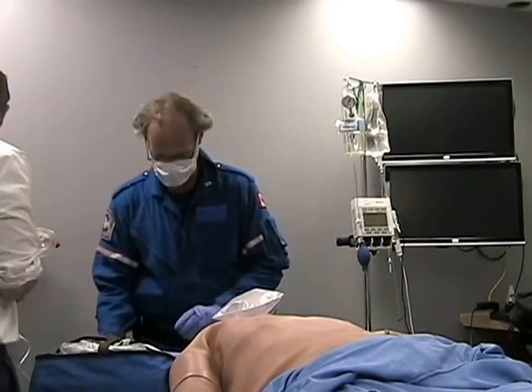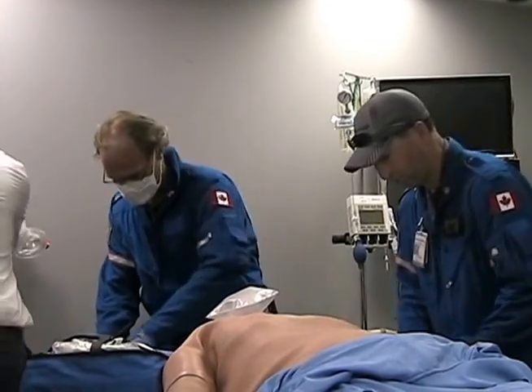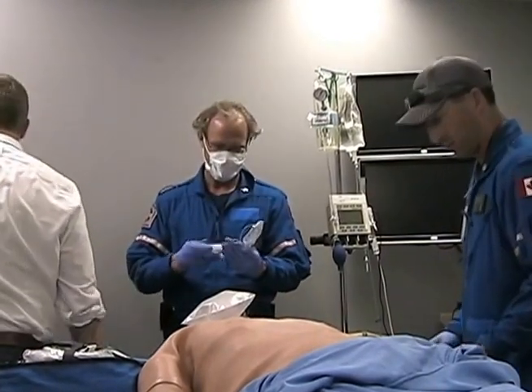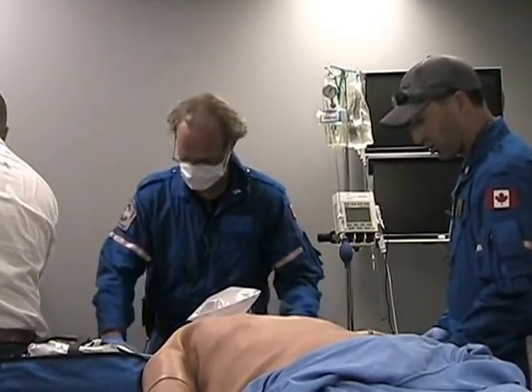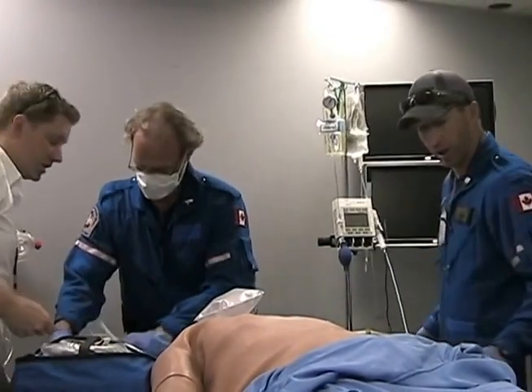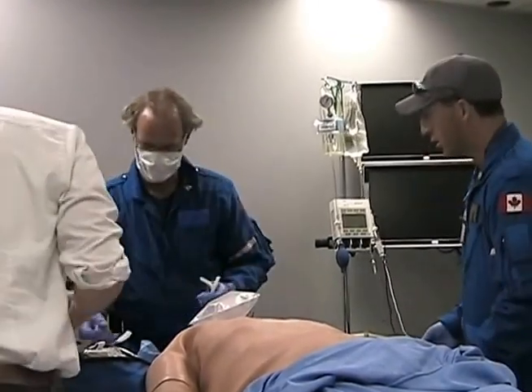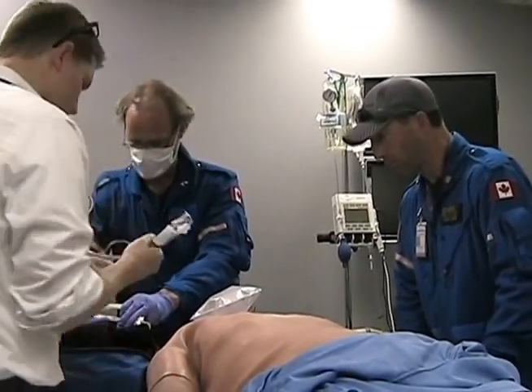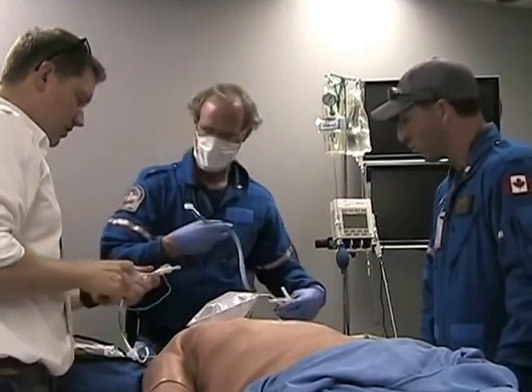Awesome, I appreciate that. Okay, can you test that suction there for me? And then I'll be getting some other things out here, and I'll probably get you to check my endotracheal tube too. I'll get that out there for you. So Scotty, I've got my drugs drawn up. I'm just having a look. It looks like my IV is functioning okay and tested, underneath here on the right pillow. Awesome, I appreciate that. Okay, here's the endotracheal tube. If you can just check that cuff, and then I want you to sit it right on his chest there, please.